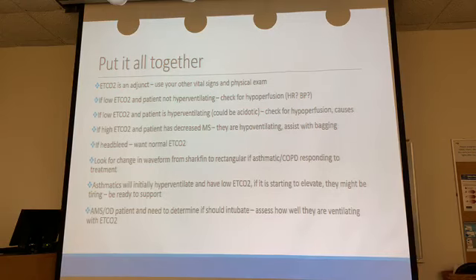Look for changes in your waveform. You know, you pick up an asthma or COPD patient, they're shark-finning. Their waveforms are shark-finning. Give them a breathing treatment and look and see if their waveform goes back to a rectangular waveform. If it did, okay, all right, patient should probably be feeling better. It looks like the medicine's kicking in. They're ventilating a lot better now. So look at the waveform to see if your treatments are working or if you need to give more.